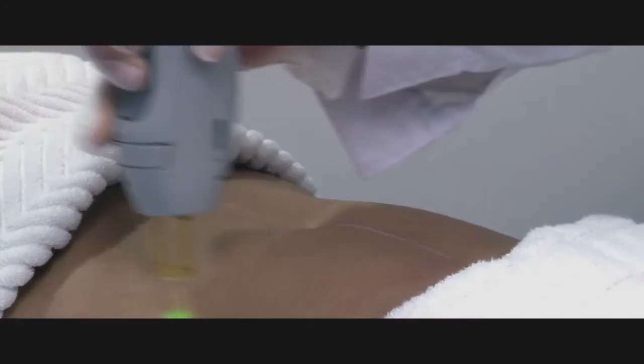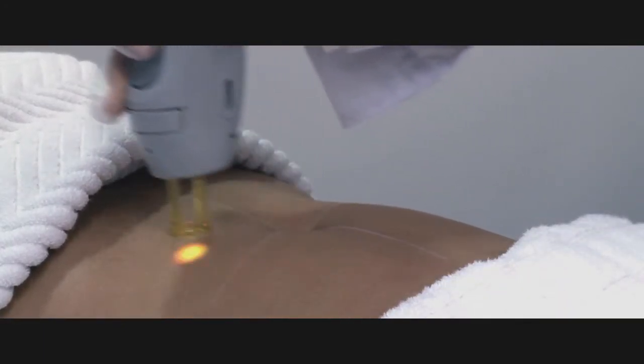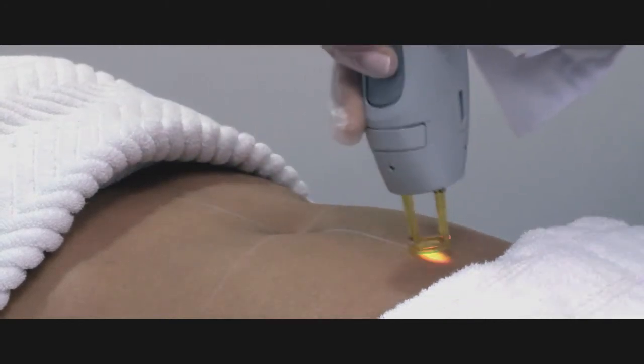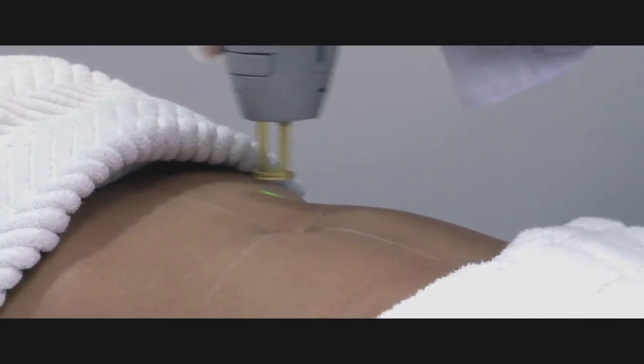The adjacent zone can then be treated. Once the adjacent zone's temperature is reached, the entire area can be passed over again in order to maintain warmth.